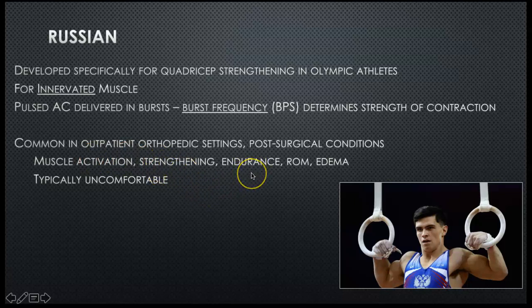You might use it to assist in someone's endurance, but you can also use it to help people gain range of motion. If they've lax range of motion, you can kind of contract the muscle to help them move through a range of motion. And you can also use it to kind of create some muscle pumping to get edema out.